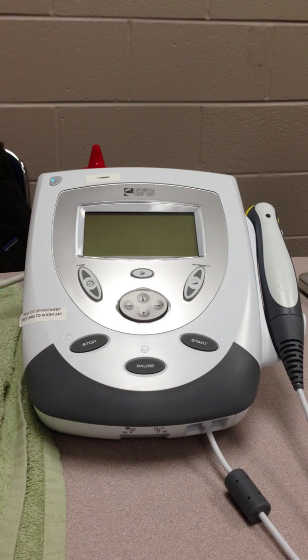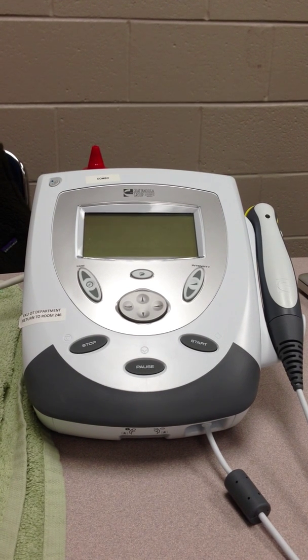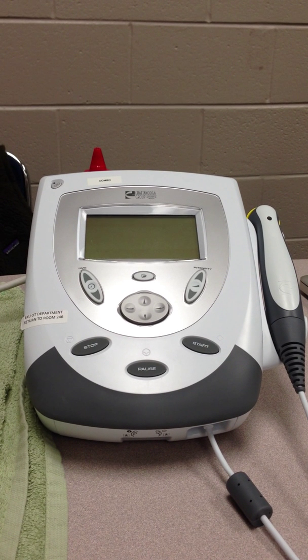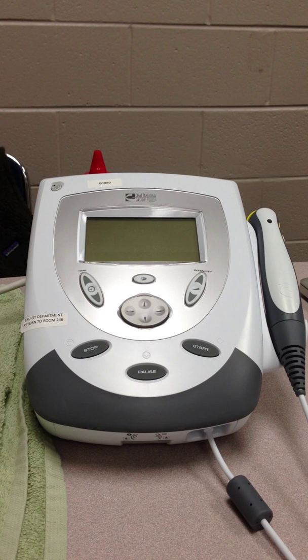Apply transducer faceplate directly to the coupling medium and maintain firm contact throughout the treatment. In all cases, keep the transducer moving when applying sound waves. Use circular movements in a rhythmic pattern at a comfortable rate of about 4 centimeters per second.